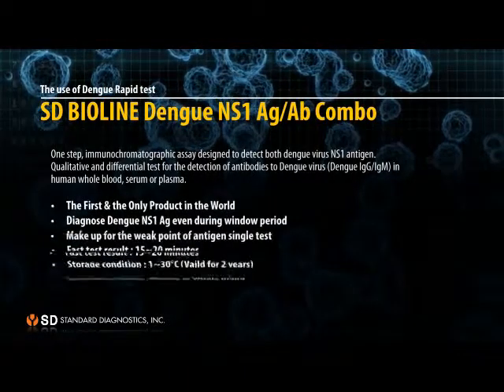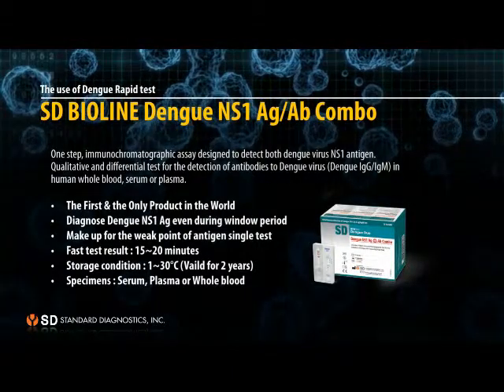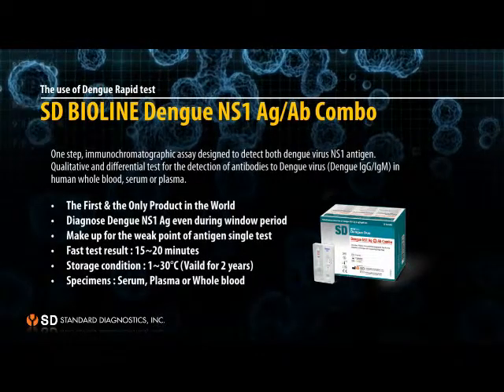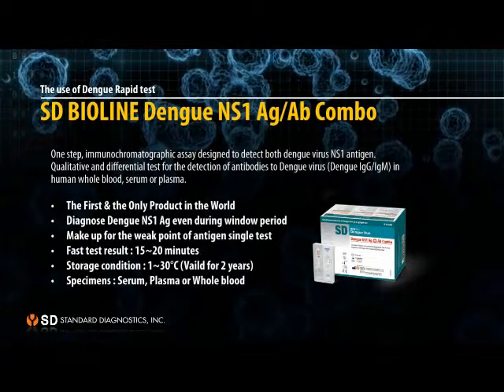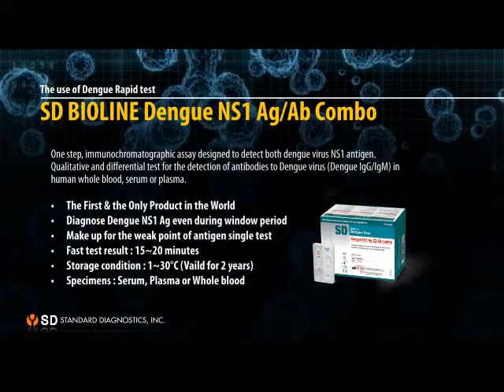SD Dengue Duo is the first product in the world to diagnose dengue NS1 antigen even during the window period. It compensates for the weak point of antigen single test. Fast test result: results will come out in 15 to 20 minutes. Convenient storage condition, 1 to 30 degrees Celsius.